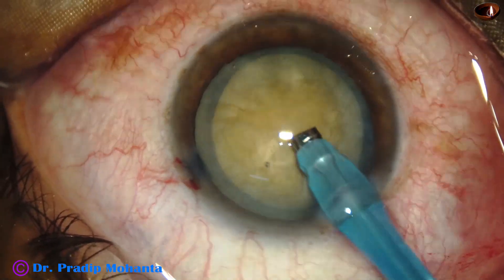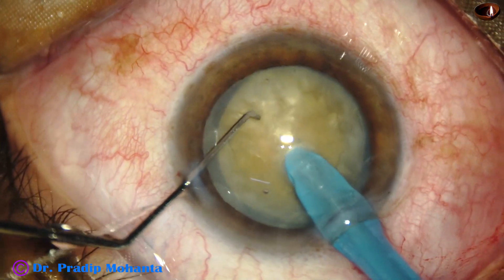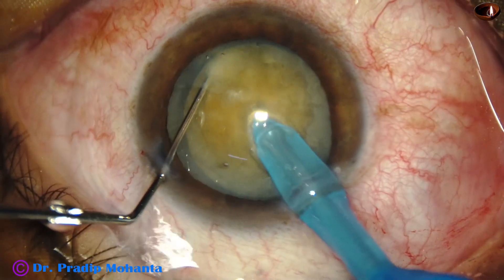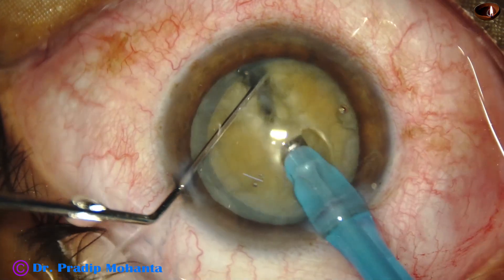Bevel is up. And now the nucleus is pushed a little down. The tip is buried in the substance of the nucleus. It goes through the substance of the nucleus towards the opposite equator. And as it reaches near the opposite equator, the chopper is used to get a nice crack.